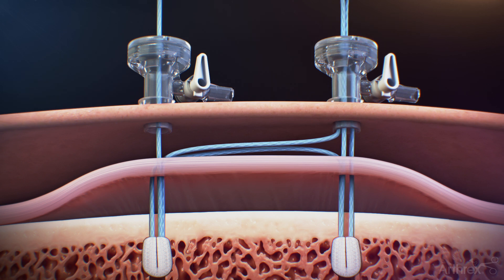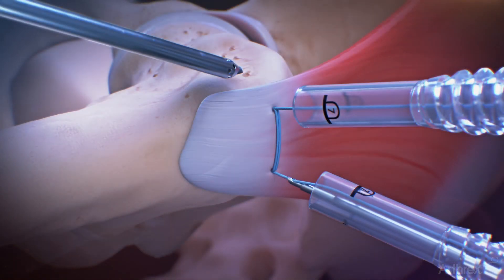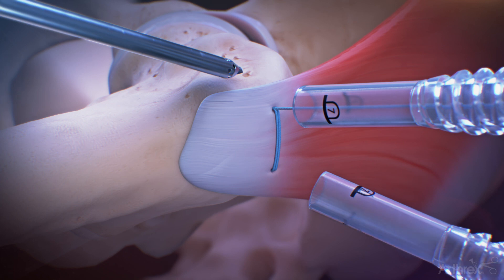Repeat the same process through the posterior lateral cannula. Equally tension the repair sutures until adequate compression of the tissue has been applied. Tension the construct and cut the repair suture limbs using the included knotless suture tensioner cutter.